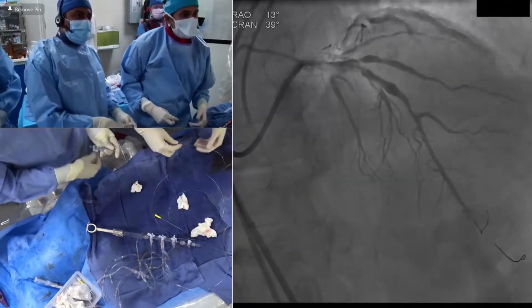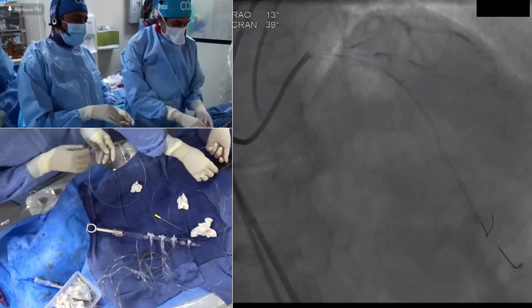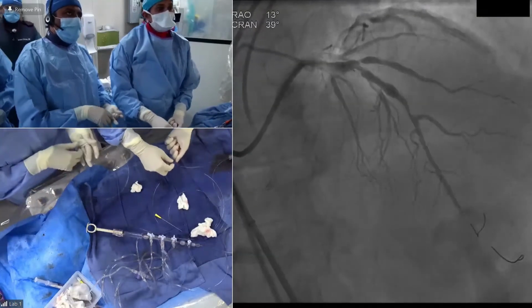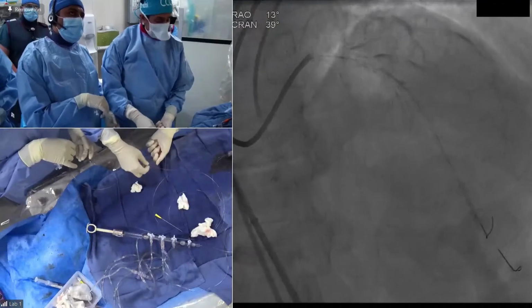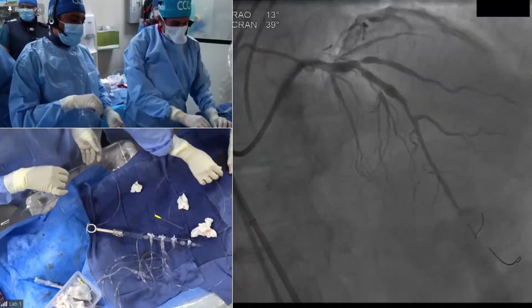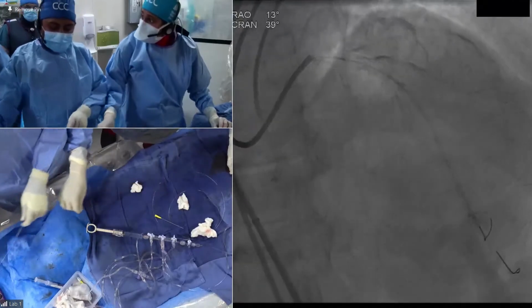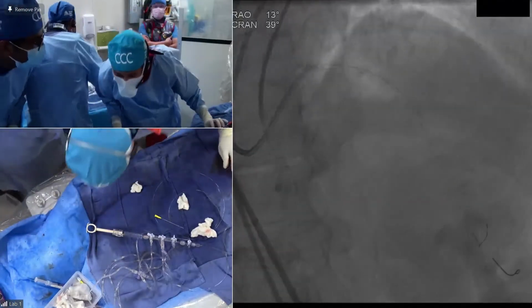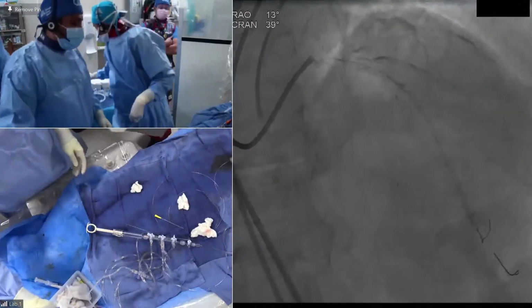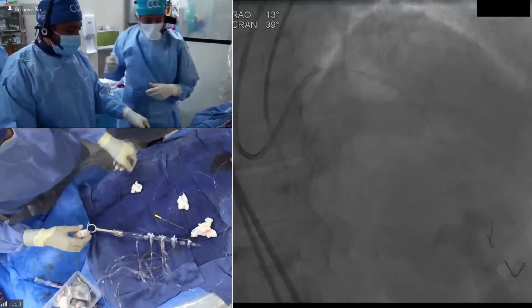It can be done, and we have done a couple handfuls, but we prefer not to. It's a high stakes endarterectomy. The plane will be developed between the adventitia. Sometimes it's very, very fibrotic, so it's very difficult because you put a balloon on a small plane to do the stentectomy.